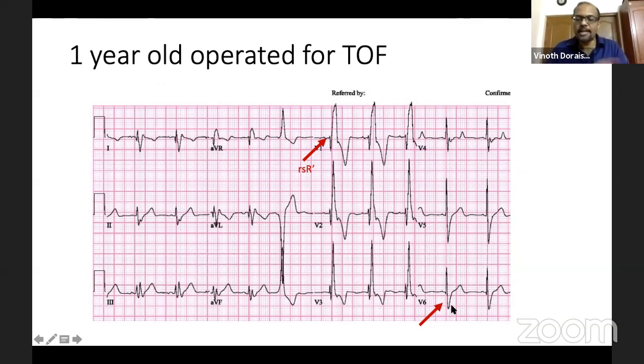That is why I told you, because the right ventricle depolarizes last, you'll have the S wave only being terminally delayed. So this is called the slurring of the S wave. Okay. So this is the complete right bundle branch block.